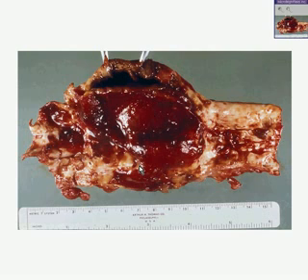Aneurysms may be filled with blood clot. The aneurysm may also rupture. The aneurysm can also show dissection of hemorrhage into its wall as well. In many cases, the original lumen of the artery may be completely thrombosed, and there may be dissection of hemorrhage somewhere within the weakened wall of the aneurysm.